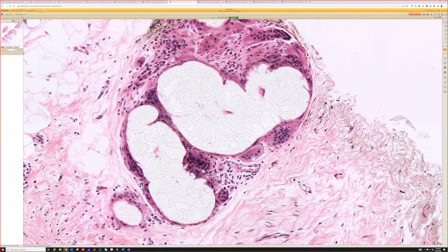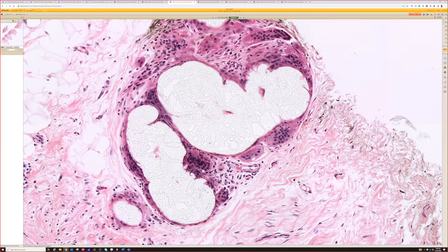We can't demonstrate this on a virtual slide, but under the microscope if you flip your condenser or put your finger under the light source, you can see a three-dimensionality to this. It's what we call refractile — the light makes the edges stand out. It looks a little bit 3D.